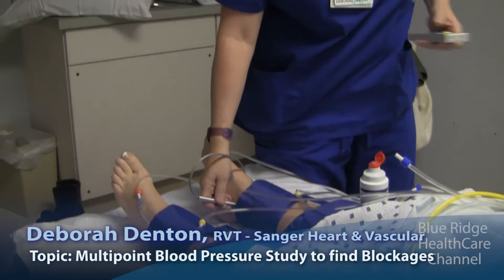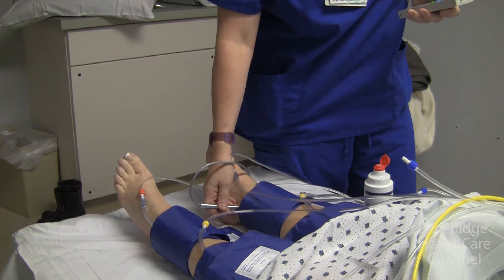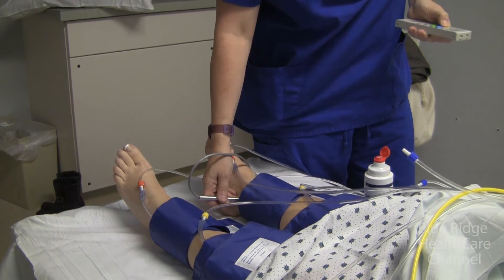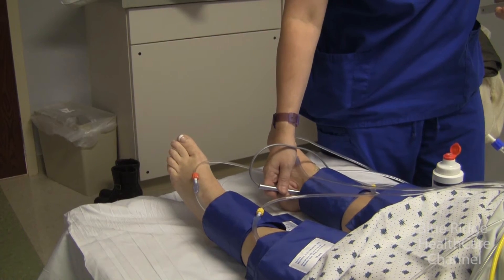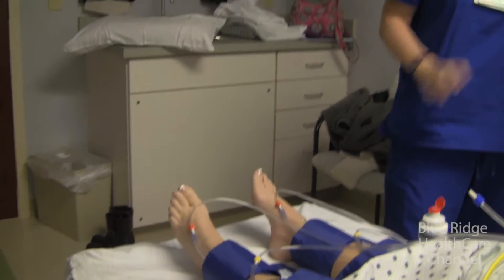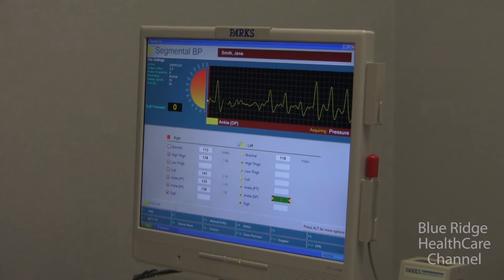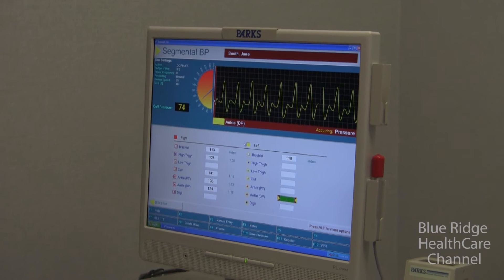So we're going to do the thigh now. It's going to squeeze a lot — it squeezes pretty tight. And that's one leg done. Right there is the trace of the artery in her ankle, and as I push up the pressure you'll see the trace go away.